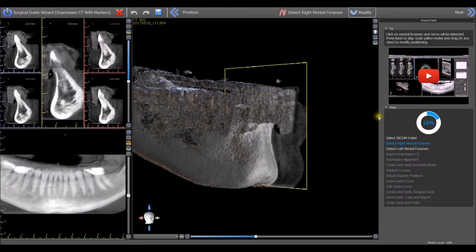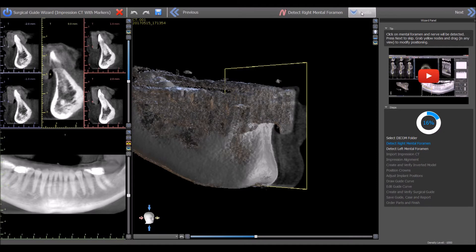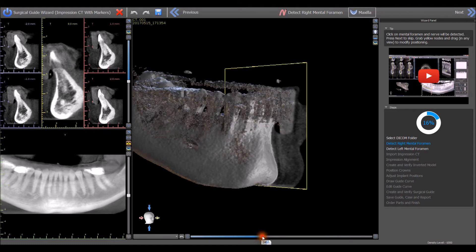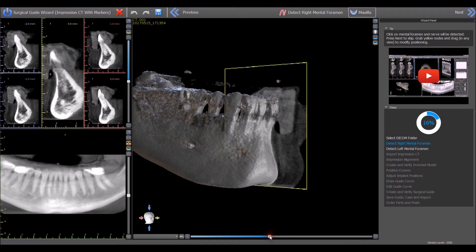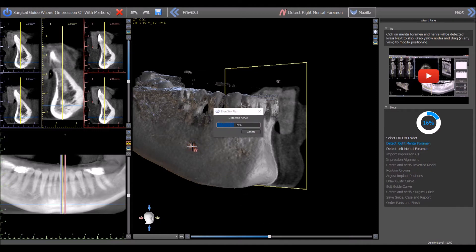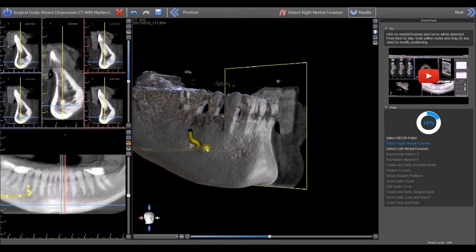For a maxilla case, press the maxilla button on the top of the screen. For a mandible case, use the slider under the 3D view to raise the density threshold and remove scatter if needed. Left-click once on the entrance of the right mental foramen to have the nerve drawn automatically. Press the Next button.